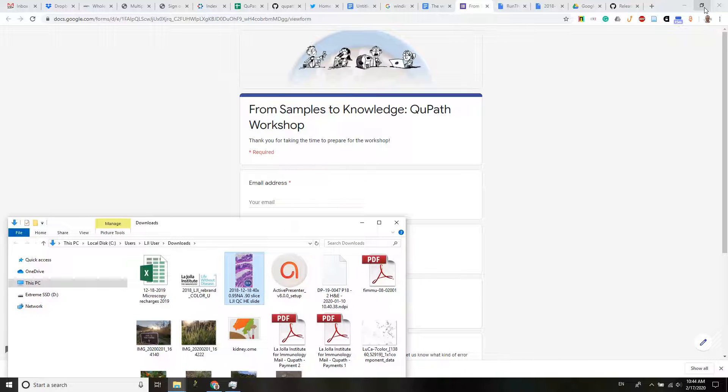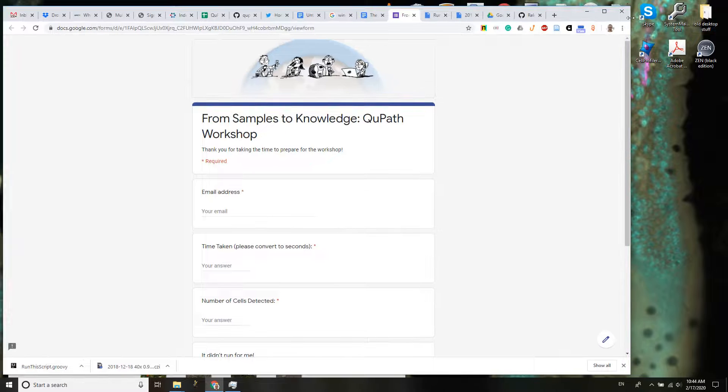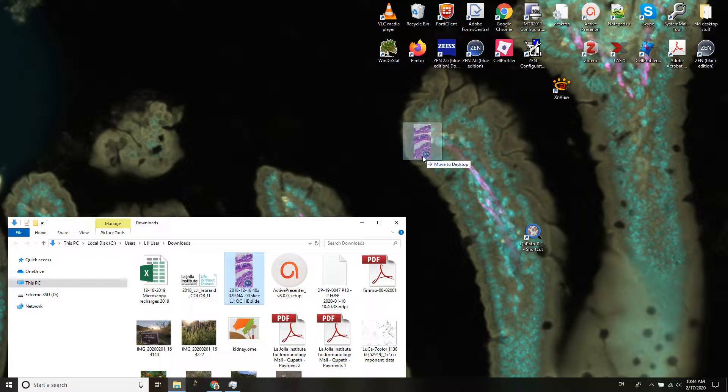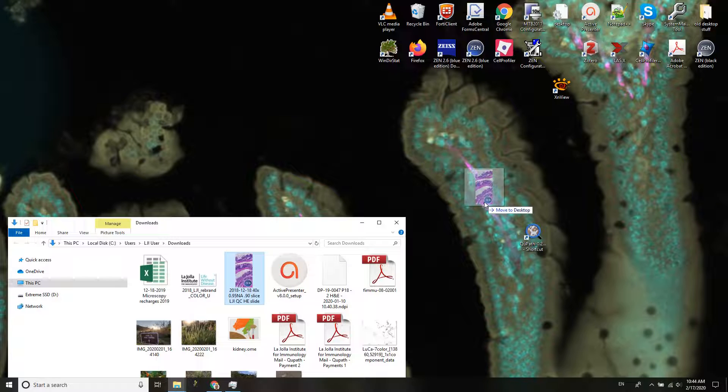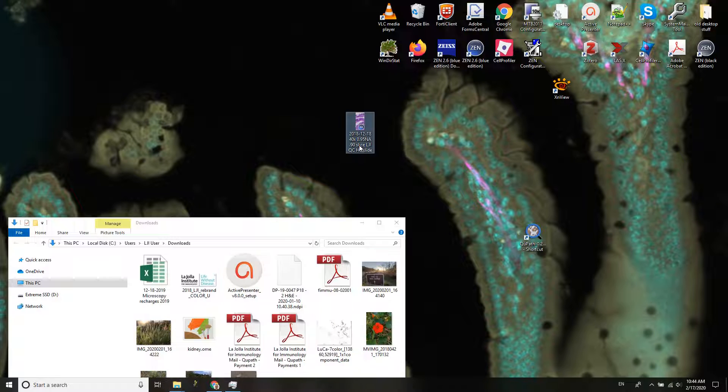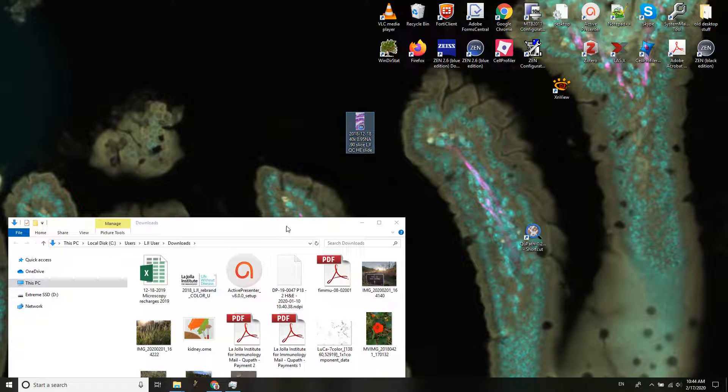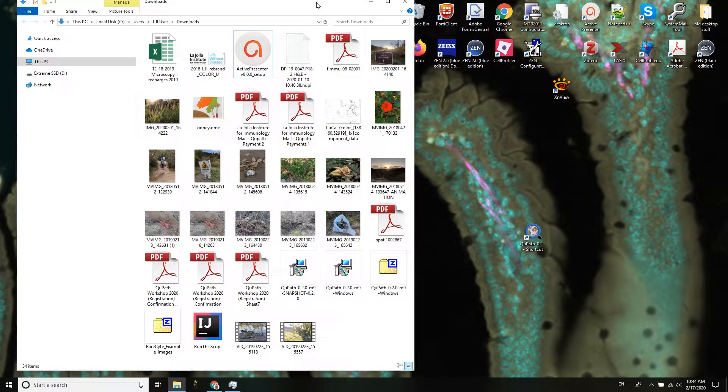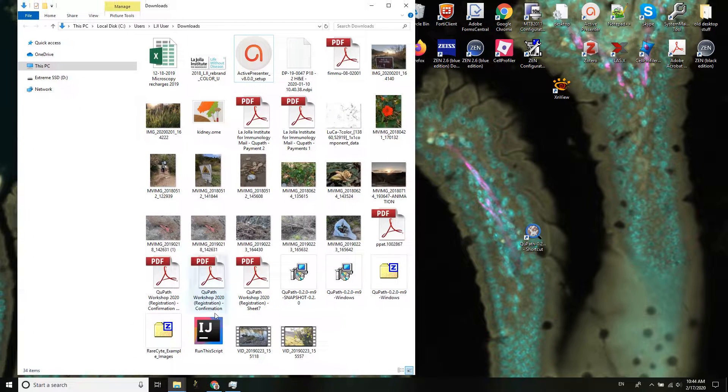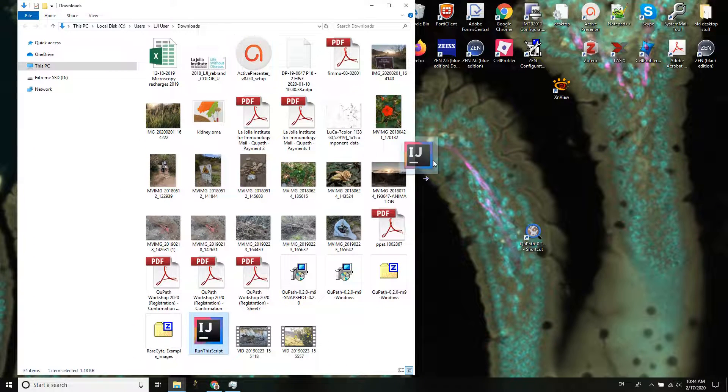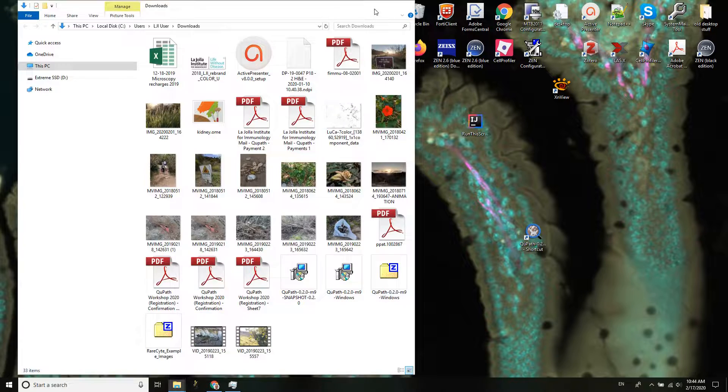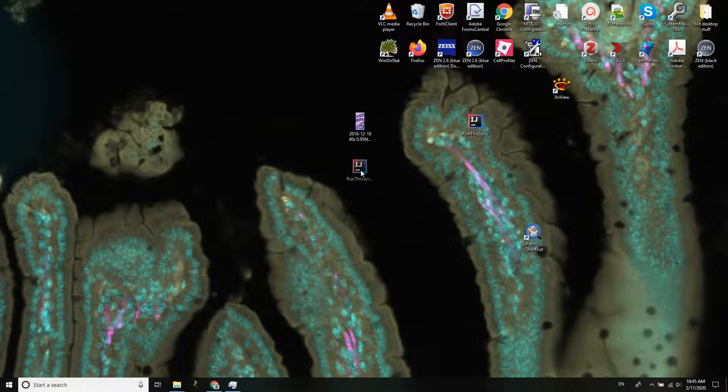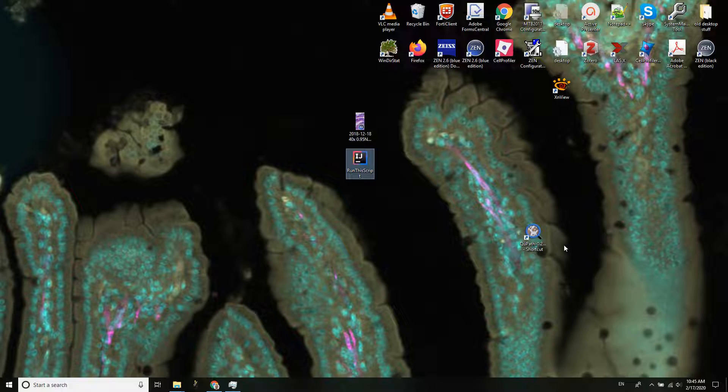And I'm just going to copy this over to the desktop. This time move is a smart move. And I also should have a script, run the script, here we go. So we have those two things, we have QuPath, we're going to open QuPath.